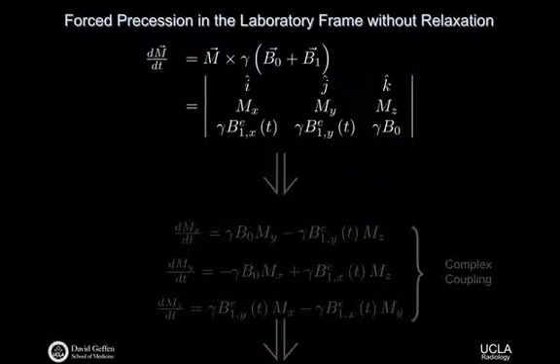Okay, so this is what we would have to start off with. We have the equation of motion on the top here, right? So we've seen this expression before, but now we have two B fields that are acting, right? It's not just the B0 field, but it's the B0 field plus the B1 field. There are two fields, they're on. B0 field, we never turn it off. B1 field, once we turn it on, by superposition, we have to have them both active, if you will.